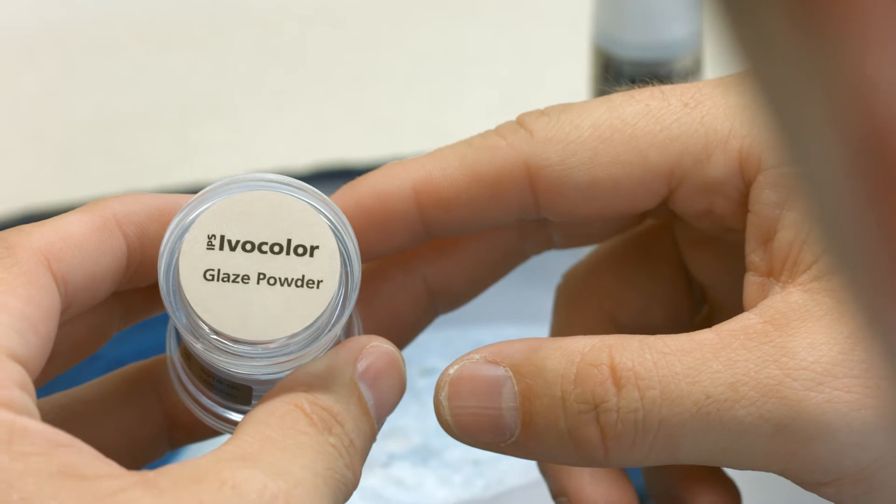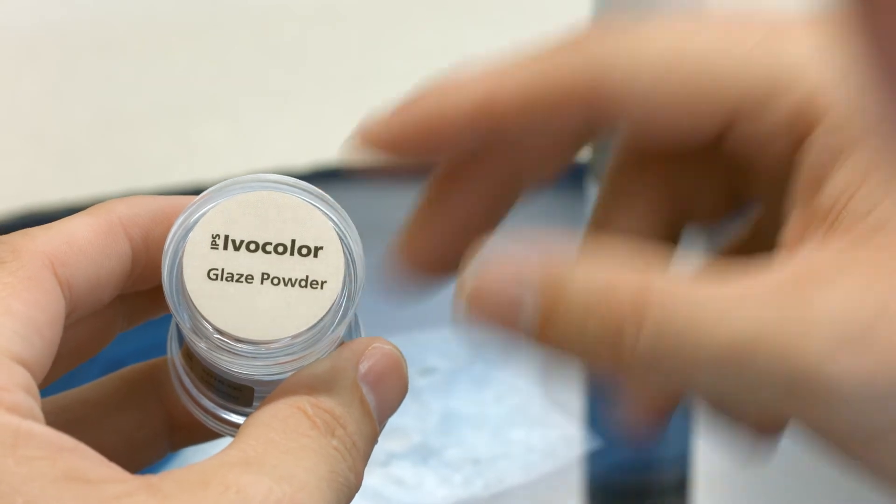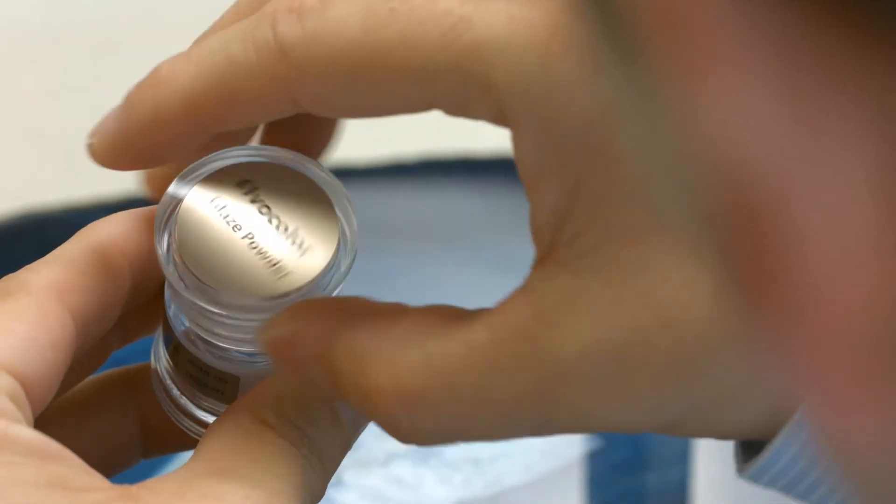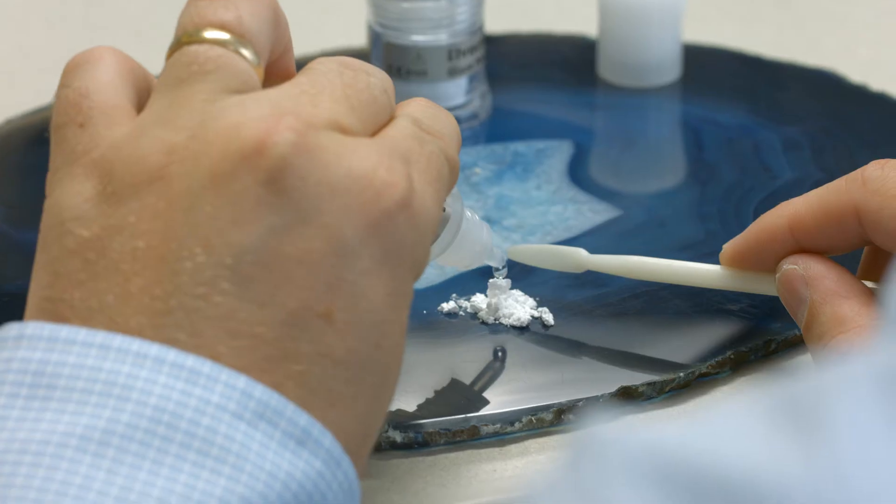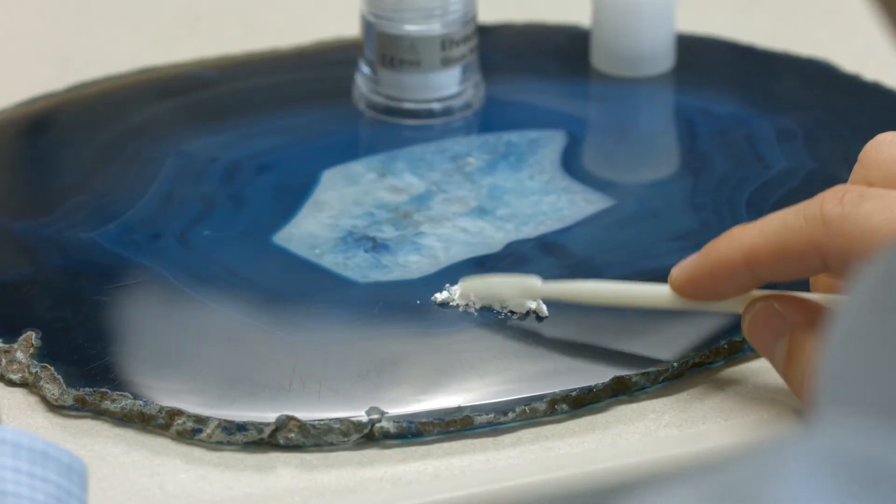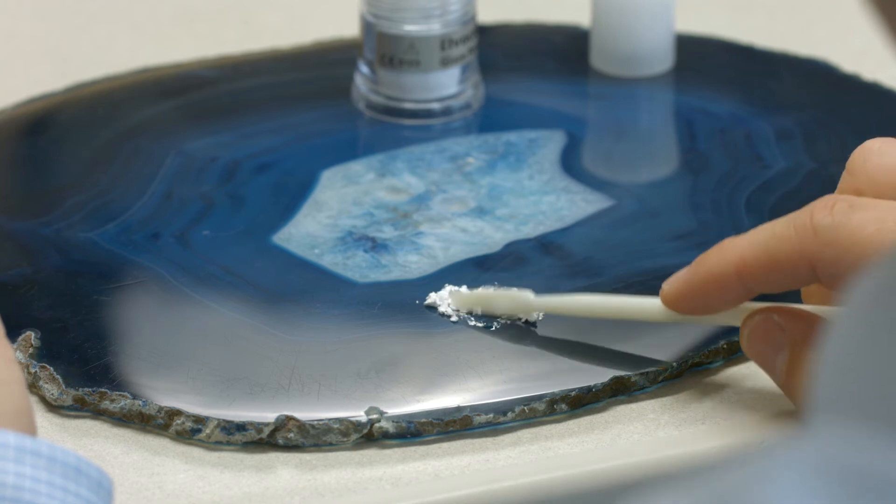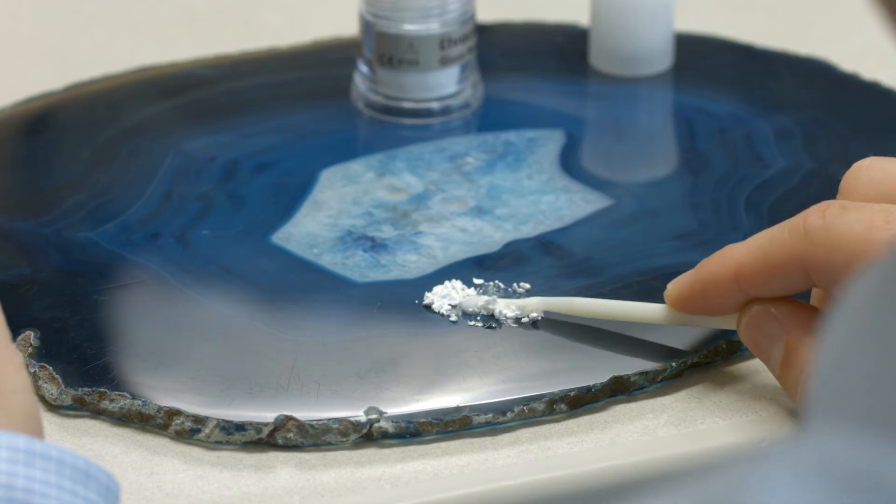IPS Ivocolor Glaze Powder and IPS Ivocolor Glaze Paste are available for glazing the restoration. You simply dispense the desired quantity and mix the products with one of the two IPS Ivocolor mixing liquids.